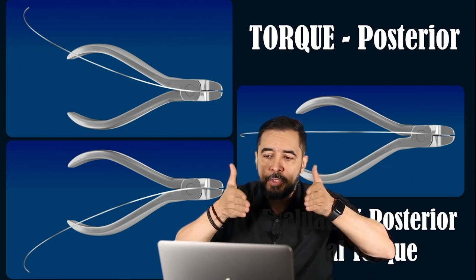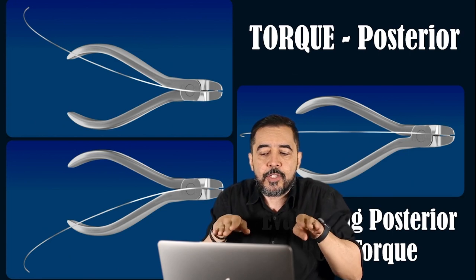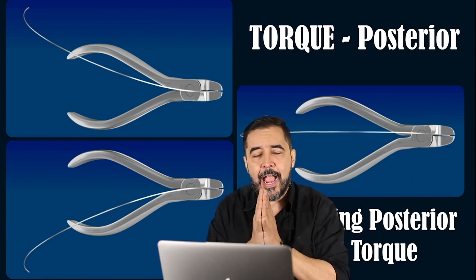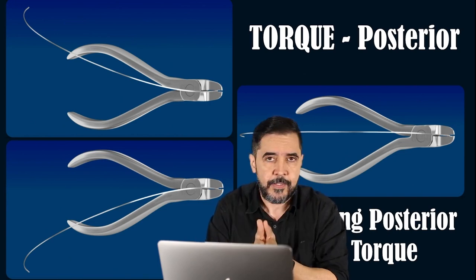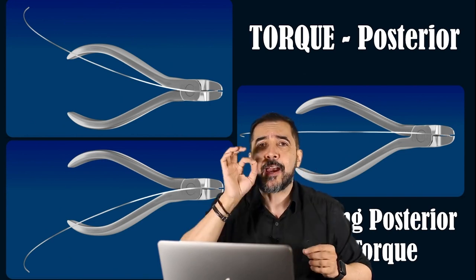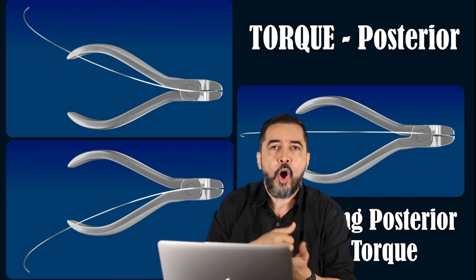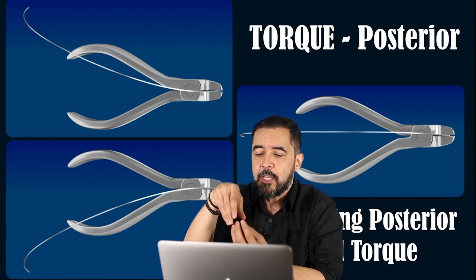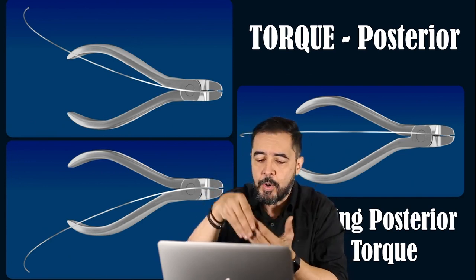They will do the inclination. The torsion of the arch wire will manage to do the inclination of those crowns. So I prefer to refer to the crown because this is what we see. This is directly what we refer to when I'm going to do some kind of adjustment in my group of teeth to do this correct refinement or intercuspation.